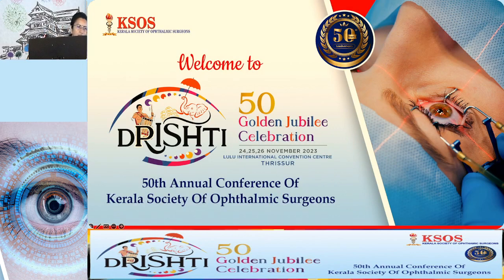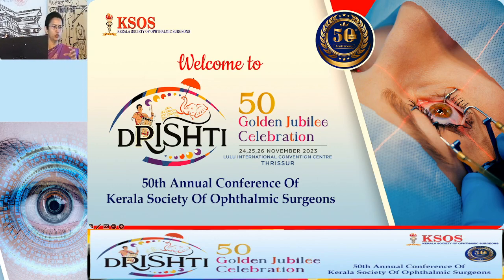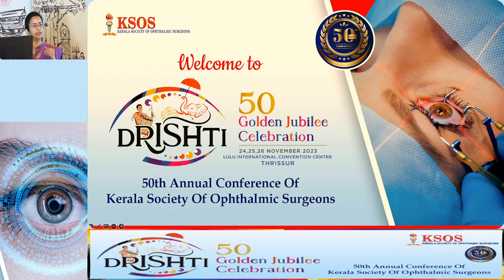Third one, madam, where I showed that oval rhexis. No, there was no CTR. I just put the lens, that's all. And then the area of contact of haptics got stretched, but there was no stretching 90 degrees away because the zonules were weak there. So that's why it assumed a spindle shape. I didn't put CTR, sir. Had I put a CTR, it would have become round because it would have equalized the force.